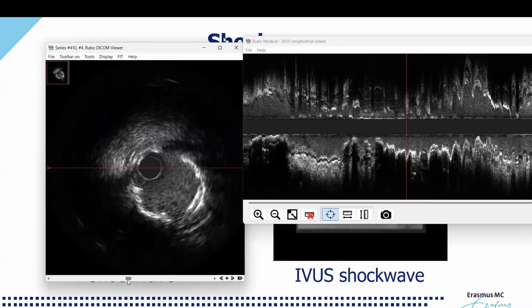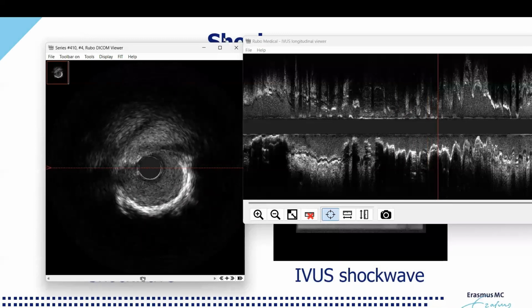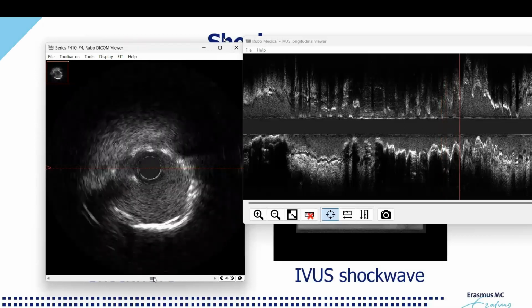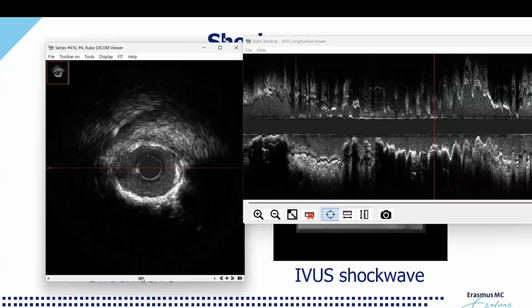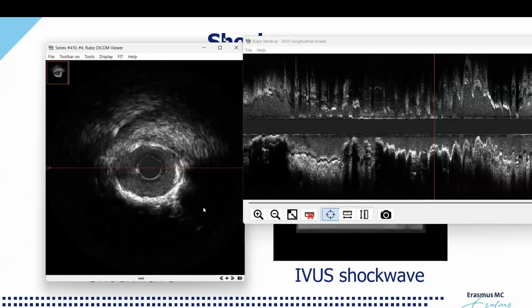Here we have the stent. And there we go. You see, we still recognize the spot in here, but you see it gave a bit away. It's very difficult to see where there were cracks. We have stent struts in front, calcium in front, but nevertheless, if I measure here the minimal luminal area, yeah, so remember it was 2.9. 2.9, and then we have here now 5.6.